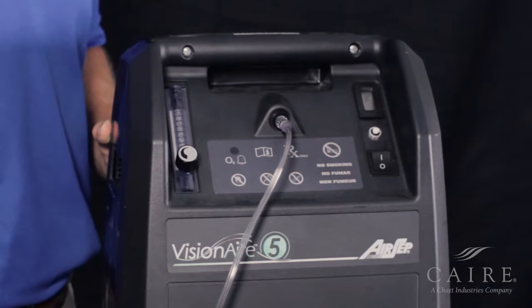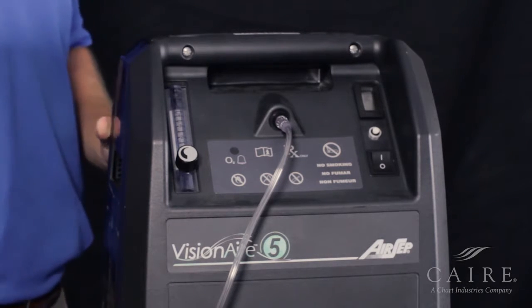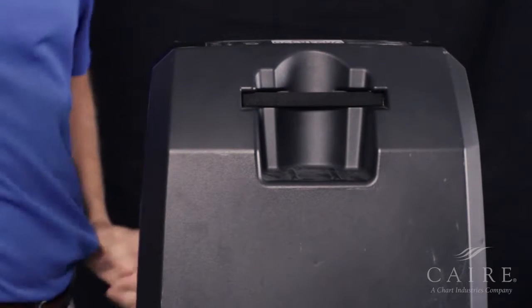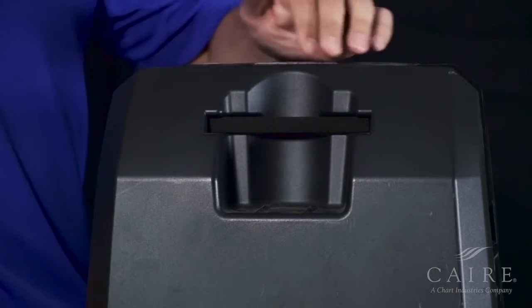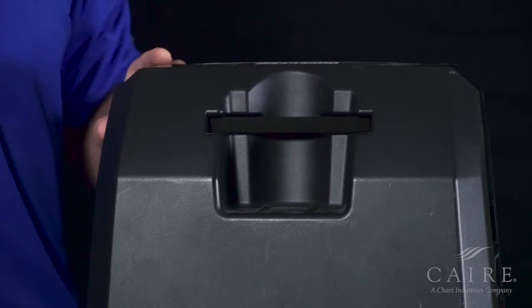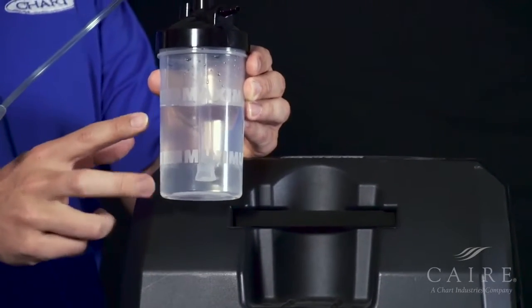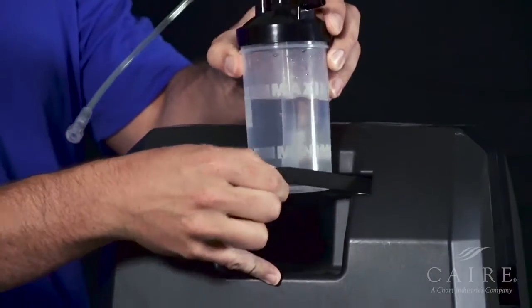You'll notice there's no spot on the front side of the unit for a humidifier bottle. Let me go ahead and show you where that option is located. Once you have your unit, you'll notice on the back side there's an indented area. This is actually where your humidifier bottle goes. Simply take your humidifier bottle after attaching the strap and making sure to fill between the minimum and maximum line with distilled water. Insert behind the strap, like so.